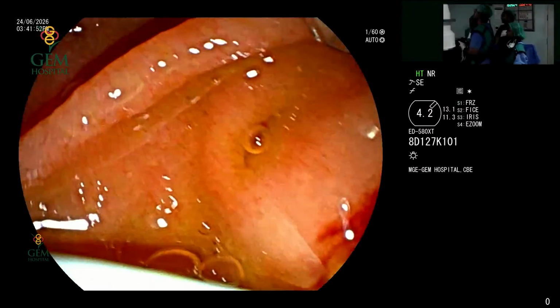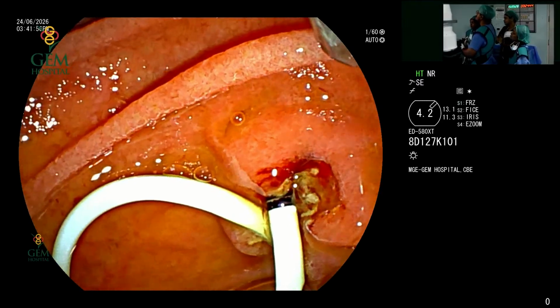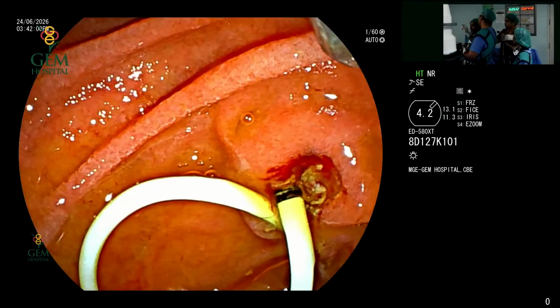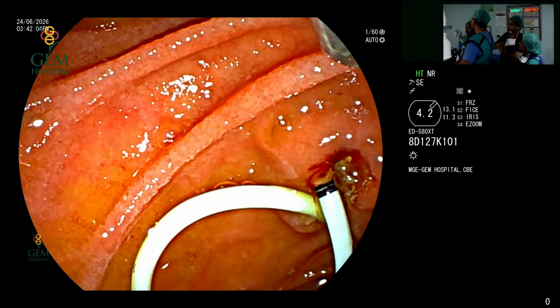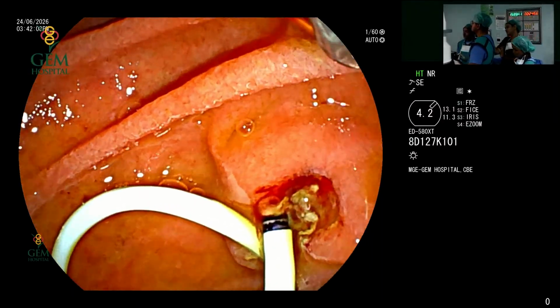And that too, a small dimple was noted on either side of the papilla. Most of the time, even in the elderly, the periampullary diverticulum itself can cause a traction and mild stricture, which can itself cause an obstruction under a non-obstructive stone.